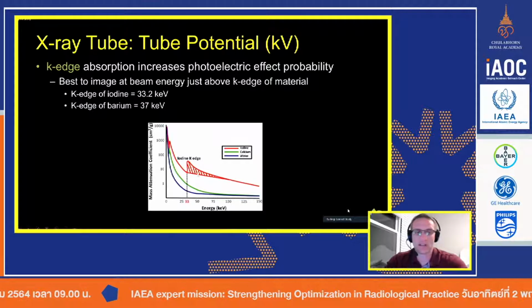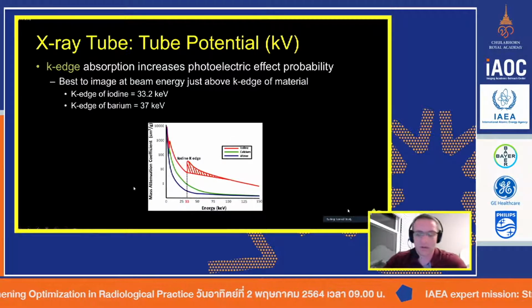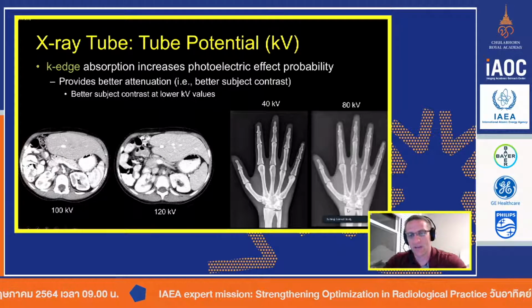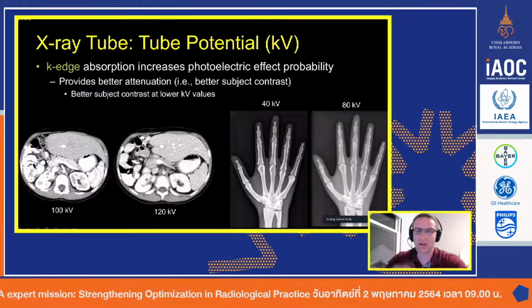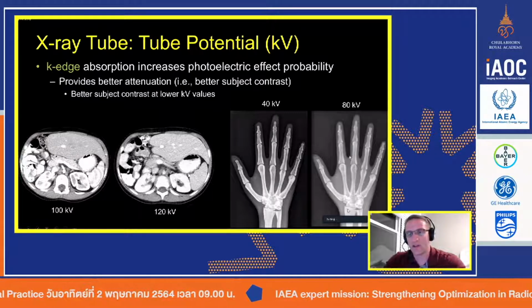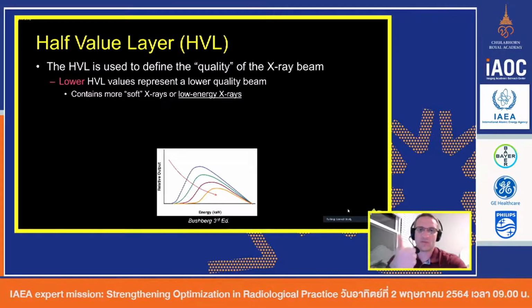Barium will have the same concept here. Barium's K-edge is at 37. So if you just take that curve and shift it just a little bit to the right, you would get barium, which is typically what we use in, of course, X-ray and CR and DR. So we've been talking iodine. Obviously, we use that a lot in CT, but you can see here that lower KV makes the calcium or the higher atomic number structures in our body stand out more from the soft tissue, in this case, water type soft tissues. And the higher the KV, the two become more the same. They take on more of the same grayscale. All right. So KV directly affects contrast.